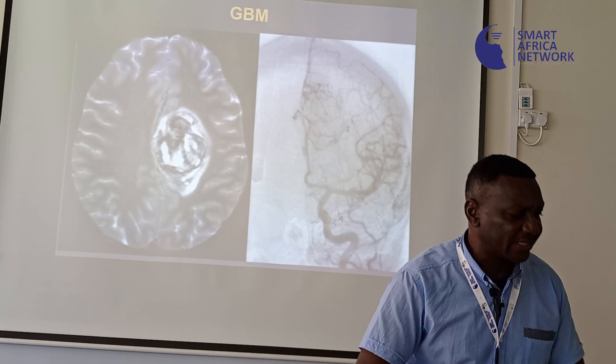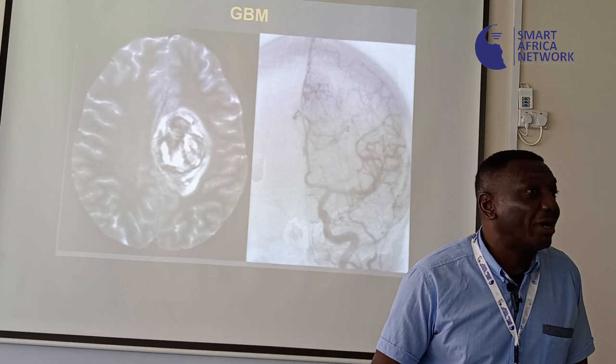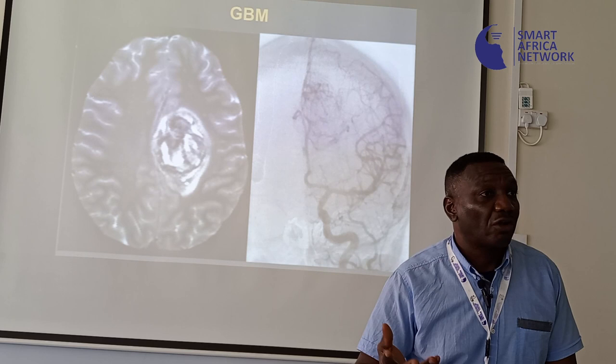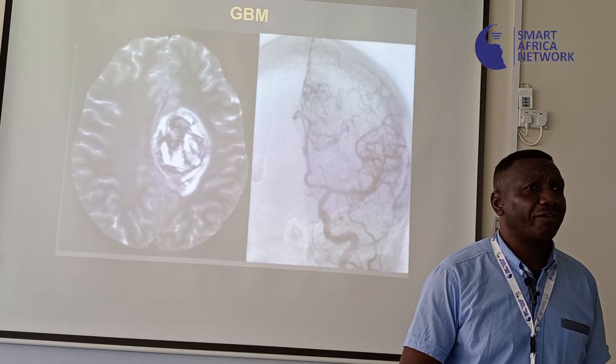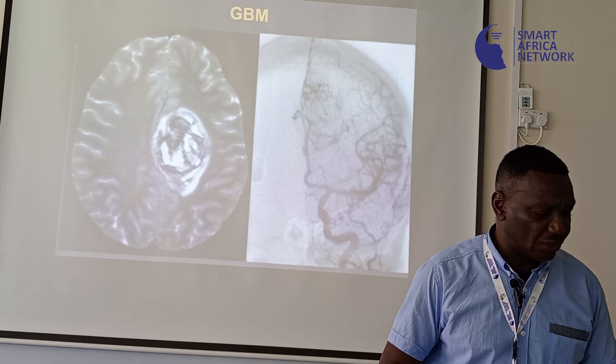Now, the other thing is sometimes MRI might not help you answer all the questions, and you keep doing other tests. So that's another test you can do. You can even do a CT. And in our own case, as clinicians, you can also do what you call conventional angiography. You can do MRI angiography. You want to look at the characteristics of tumors and all that. So MRI has several of these applications that are being used.